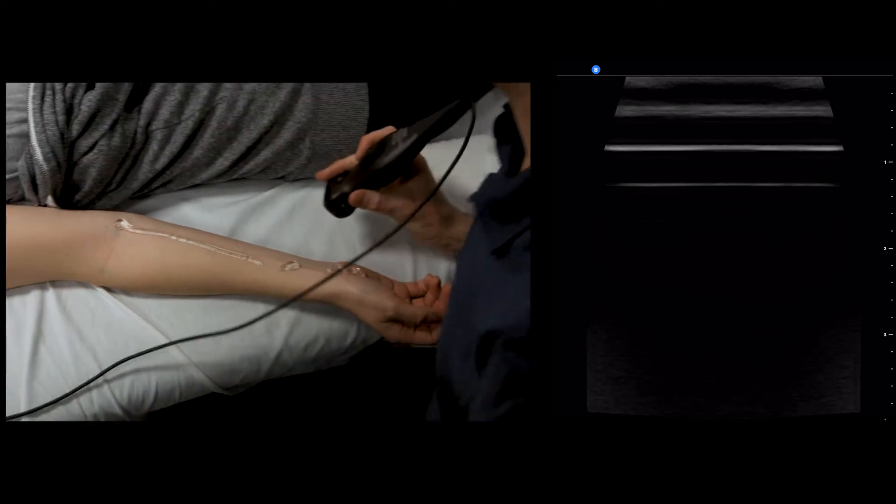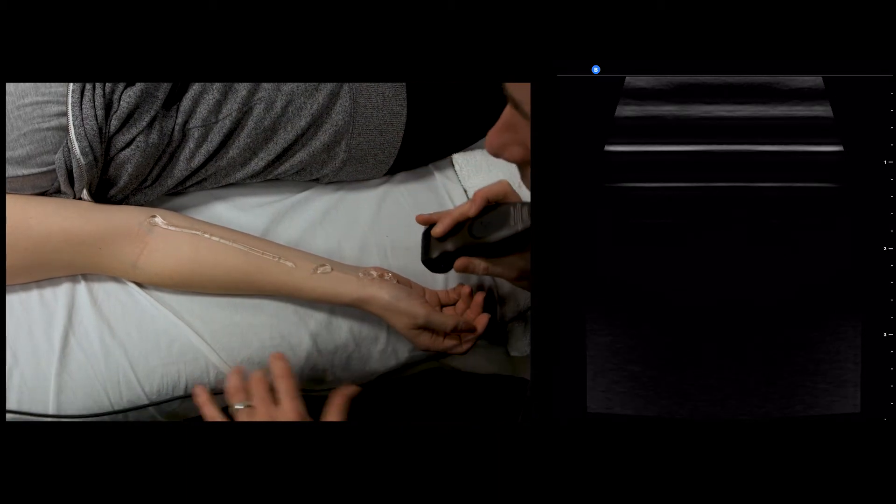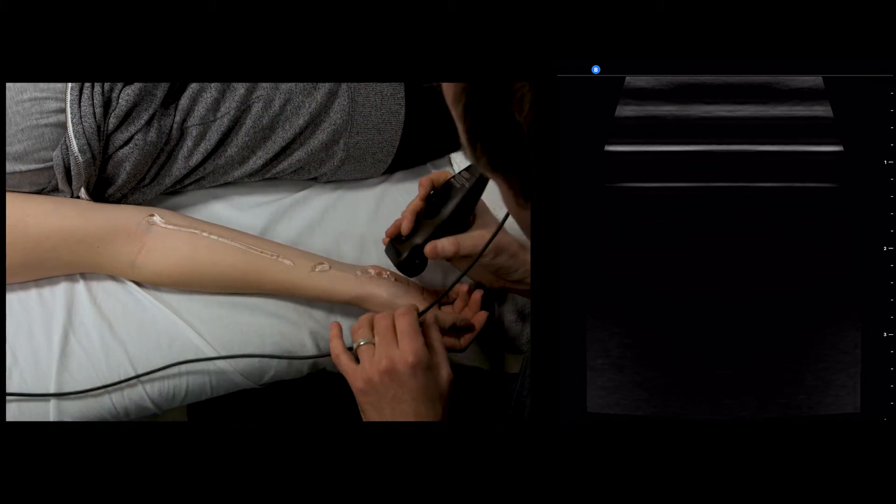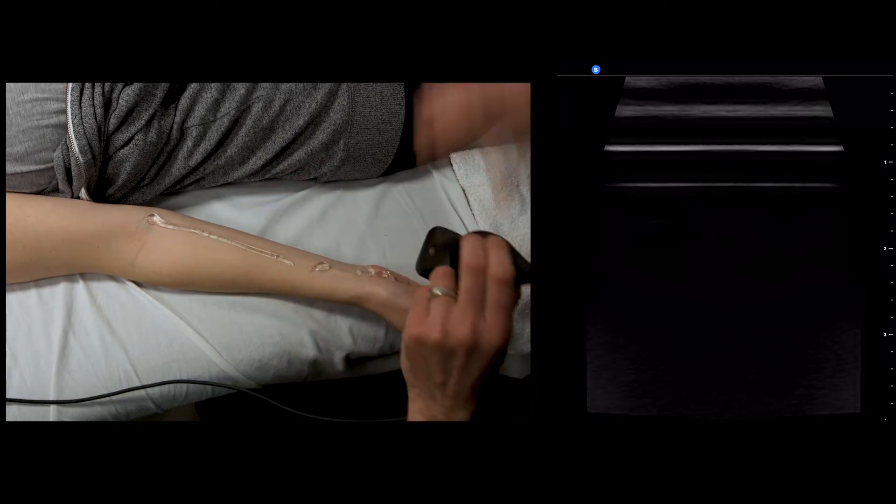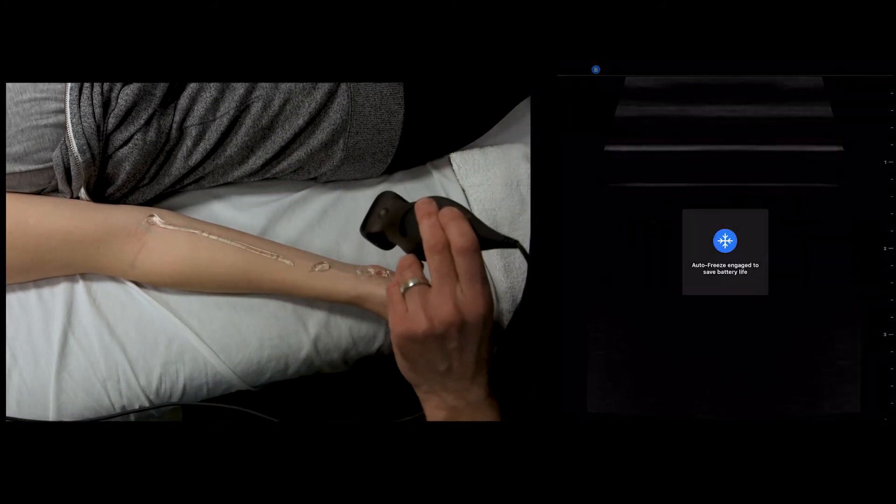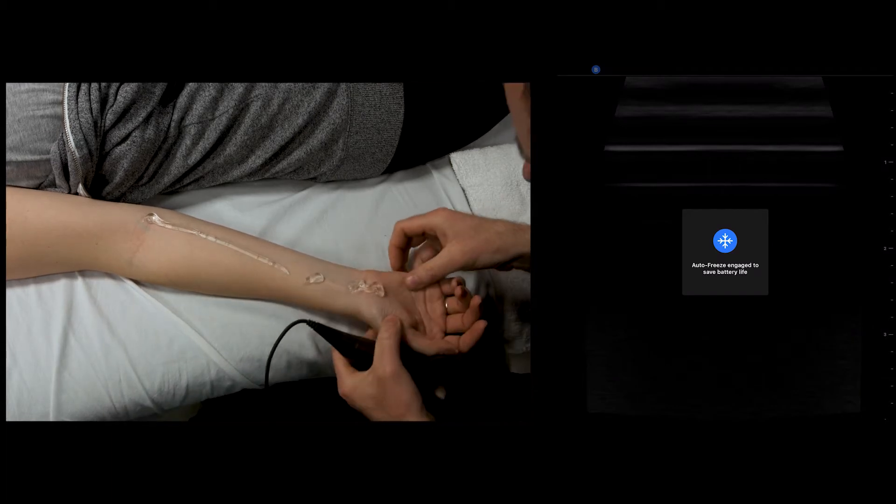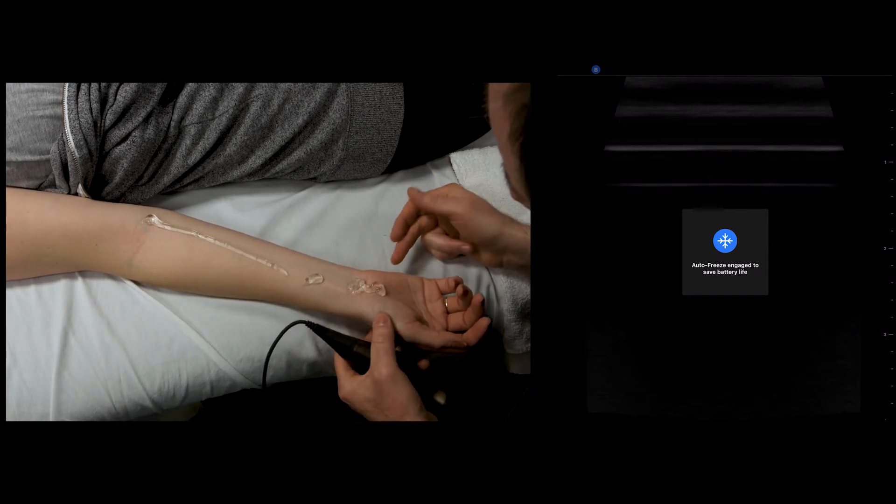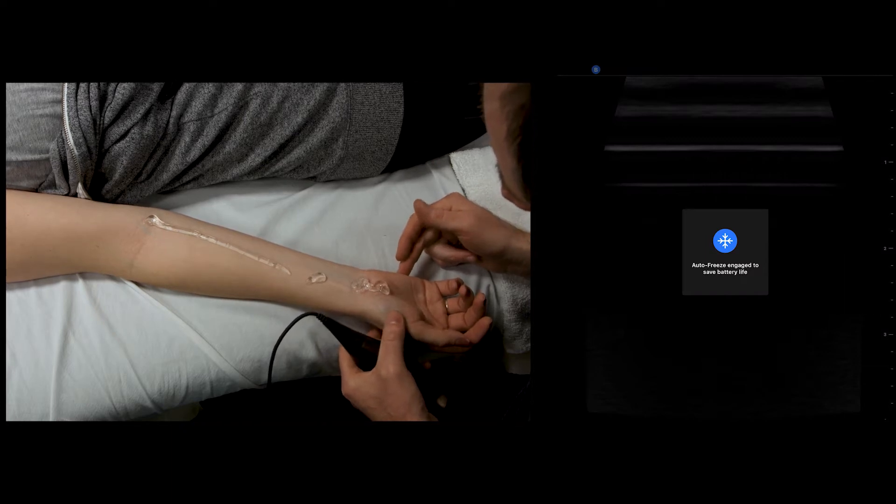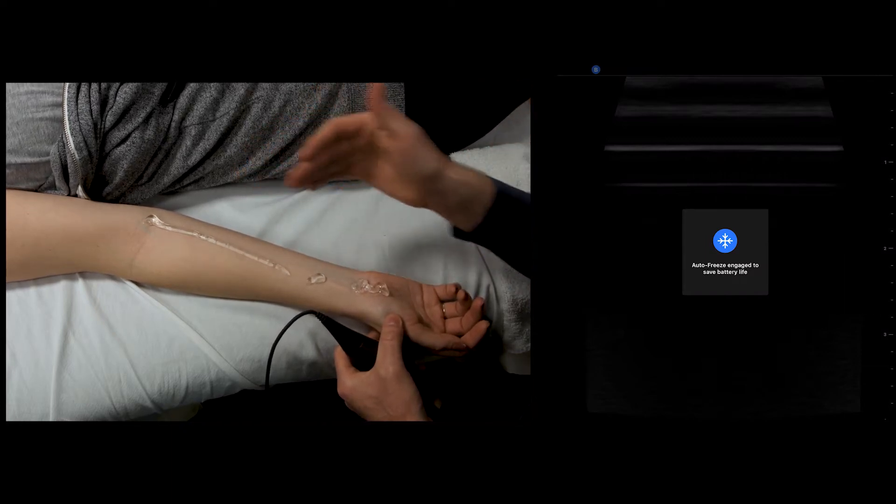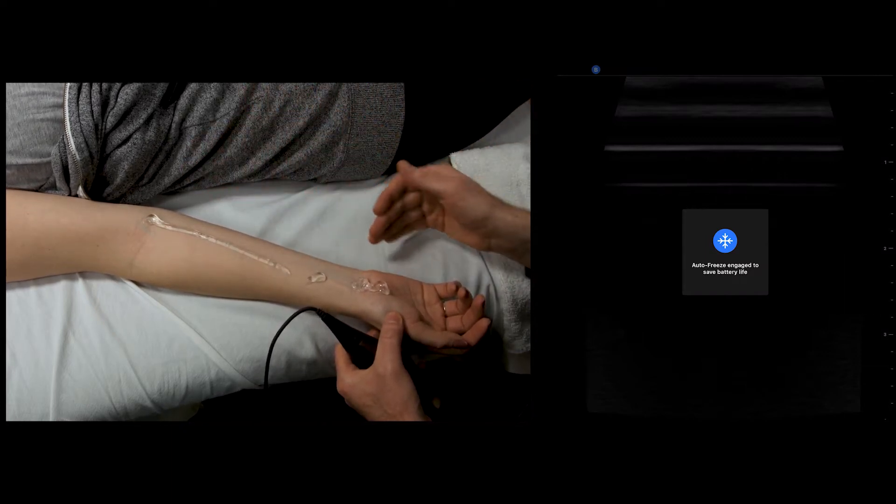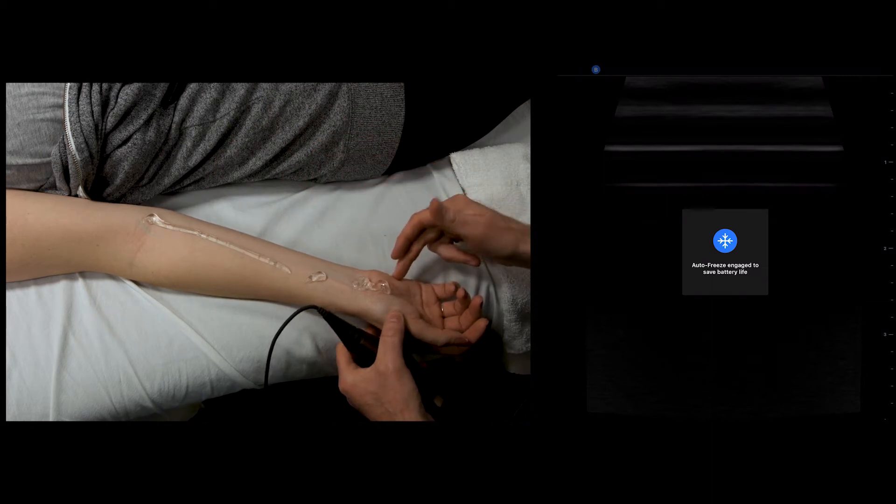This is the median nerve with the Butterfly ultrasound. I've got the median nerve outlined here with a bit of gel on the palm. We are going to look at the median nerve through the forearm, up through the antecubital fossa, and down into the carpal tunnel.